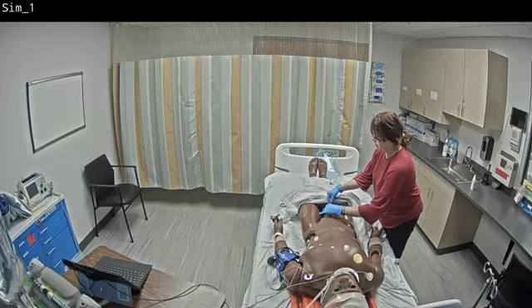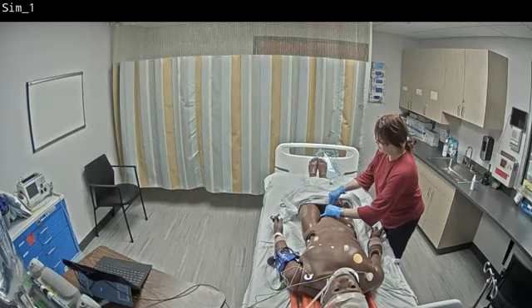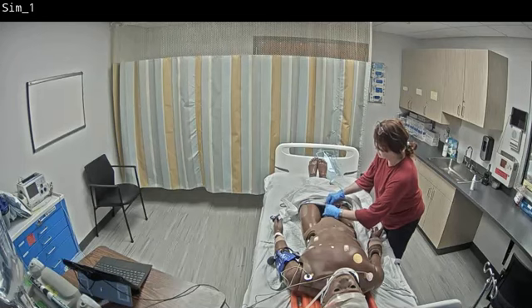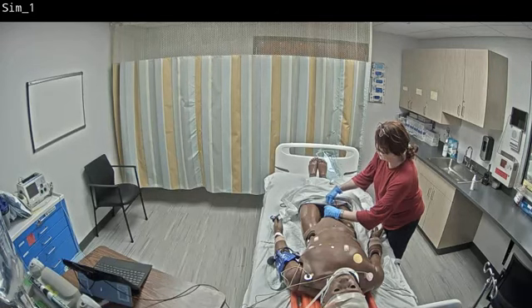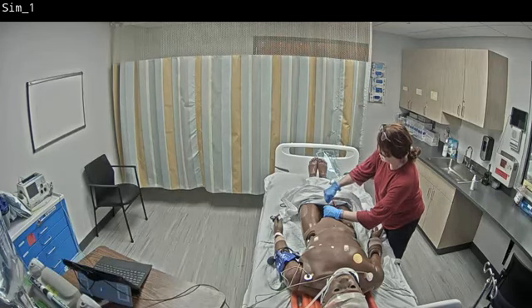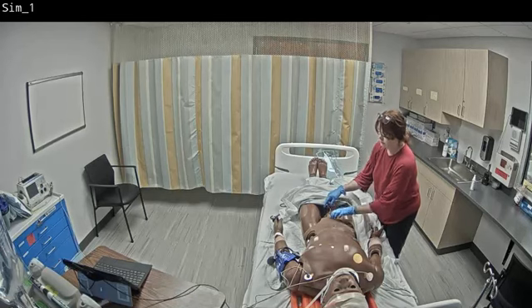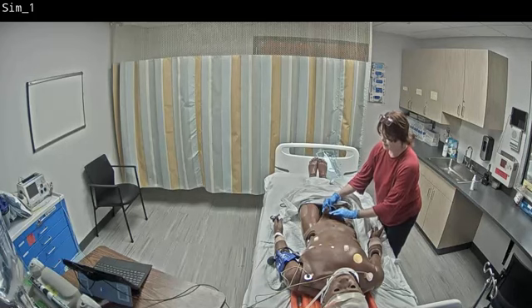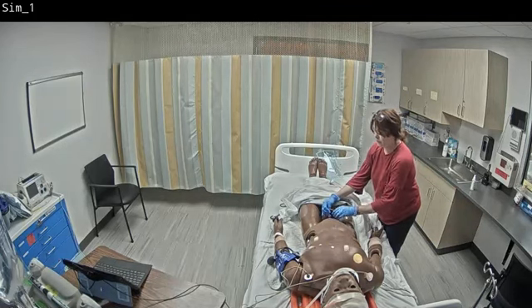And then when you're inserting it into the simulator, there will be a little bit of resistance. You can get past that resistance. It won't go. Okay, there it goes. It popped in there. I'm going to cheat here so you can see what it looks like. So, see the catheter is coming through.